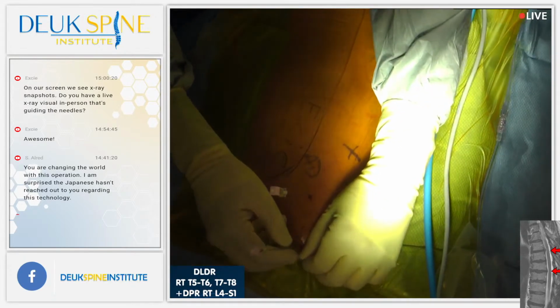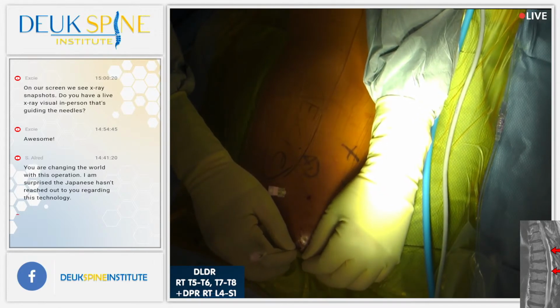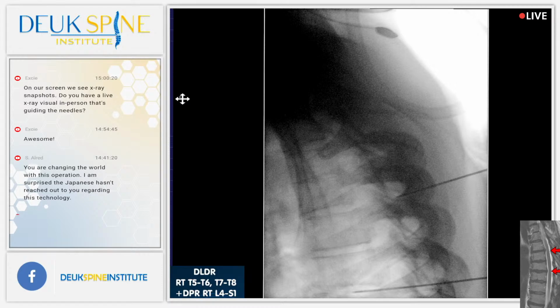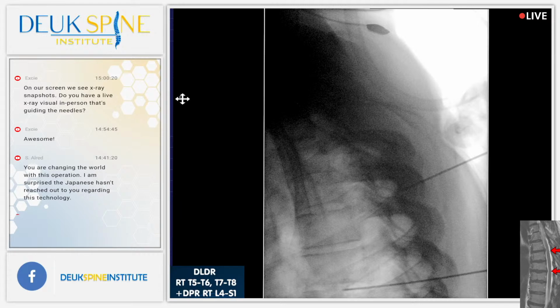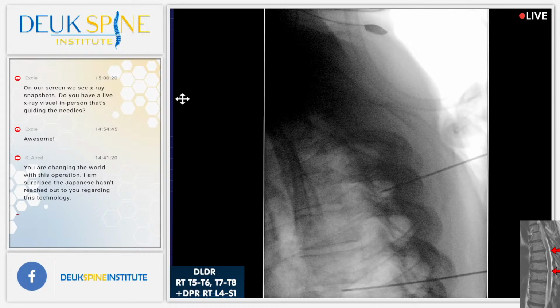Well, I'm not going to take too much chances here. I'm going to keep trying. Are you okay? I'm going to keep trying a little bit more to get in here. But at some point, I'm just feeling solid bone. You know what I could do? Shot? Could just pull the skin up a little bit and see what we can do there. Shot? All right, that seems to be better. Remember, when I say shot, what I'm really doing is getting a picture. It's an X-ray image. And there's something just obstructing my path here.